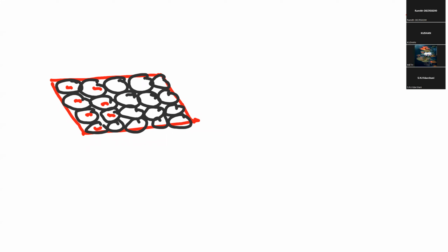Heart cell ඔක්කොම negative. මොකද්ද මේ දැන් මේ heart එක මොන තත්ත්වයේ තියෙන්නේ? resting membrane potential. resting membrane potential එකේ කාට හරි කියන්න පුළුවන්ද වෝල්ටීයතාවය? minus 90 millivolt වලින් තියෙනවා. දැන් ඔහොම තියෙනකොට අපි ගේනවා මෙතෙන්ට galvanometer. This is the galvanometer.